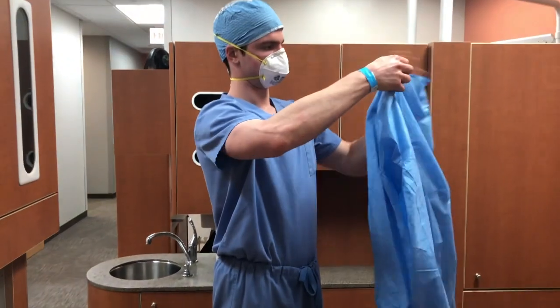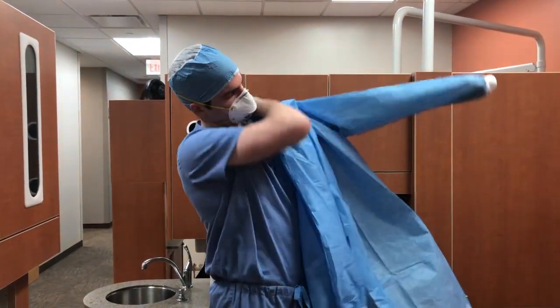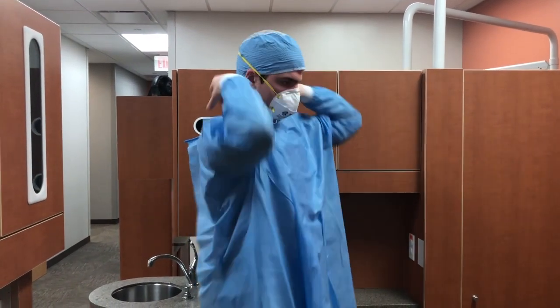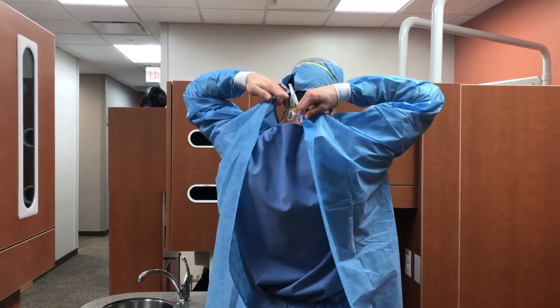Fasten the gown around the back of the neck and around the waist, making sure that you tie behind your waist, not in front of your waist.